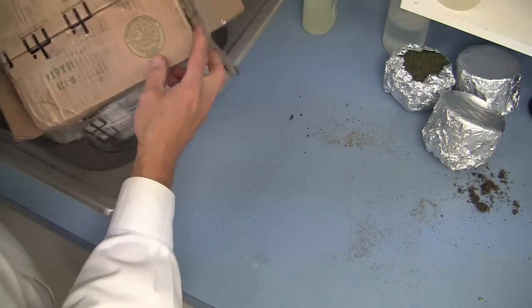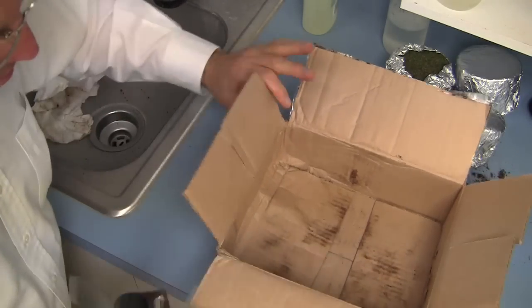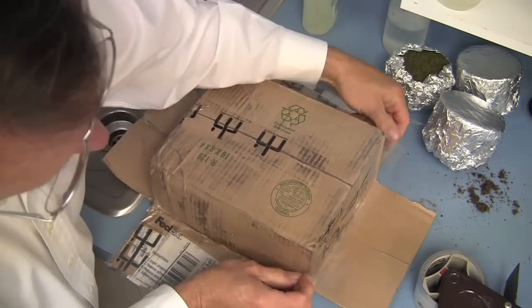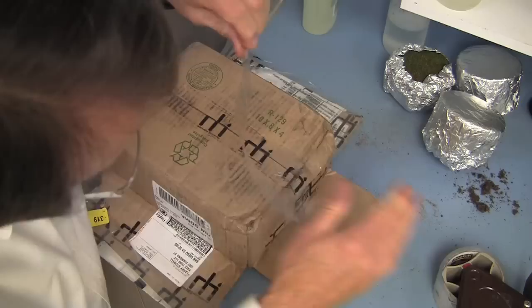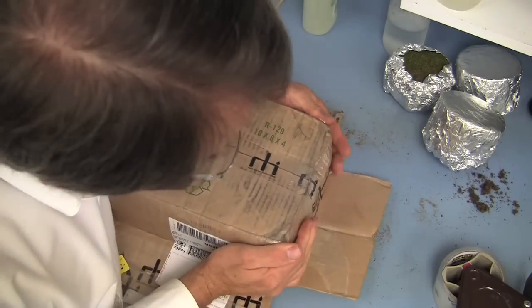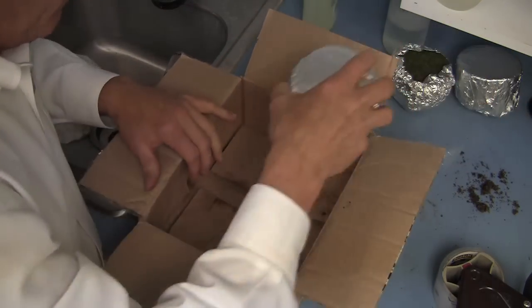Let's take a look at shipping a sample. We'll pack it in the same box it came in, just with new wrapping materials. The first thing you want to do is improve the integrity of the box by sealing off all of the openings so that nothing can leak out. Now the whole bottom of the box is sealed — let's put our samples in.